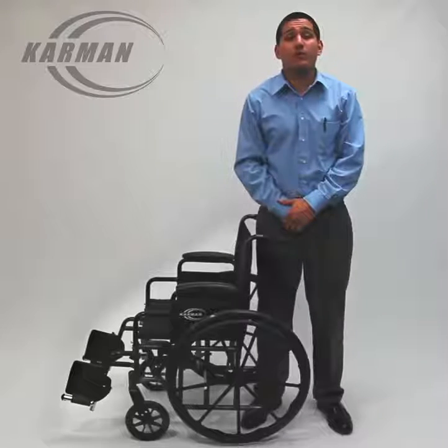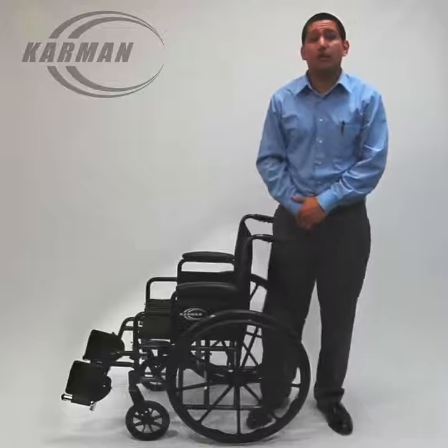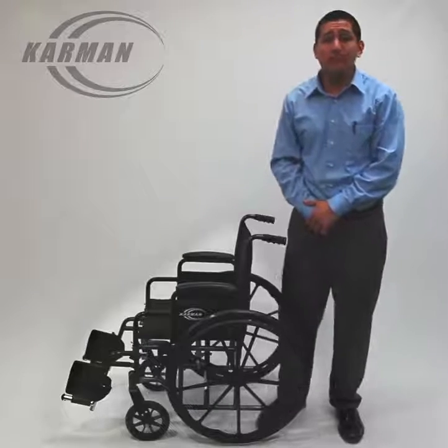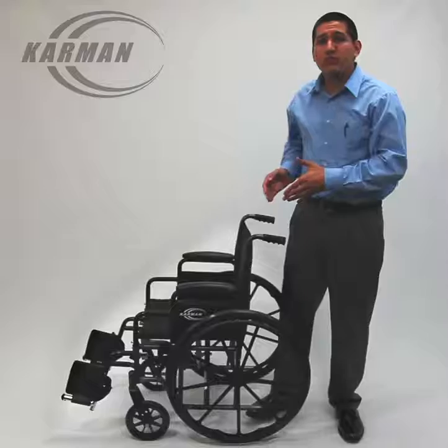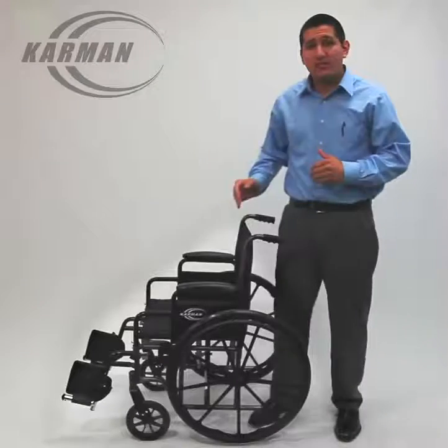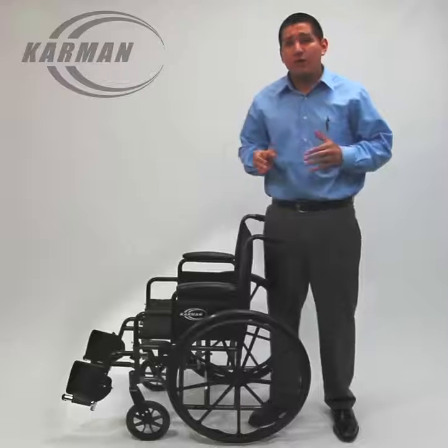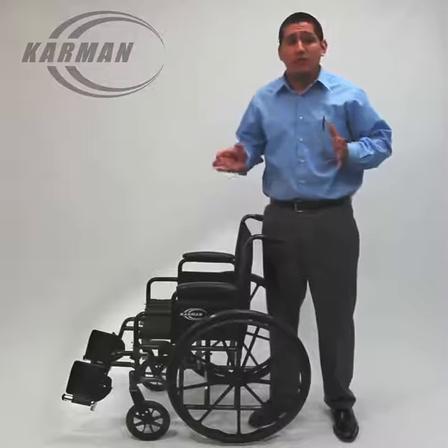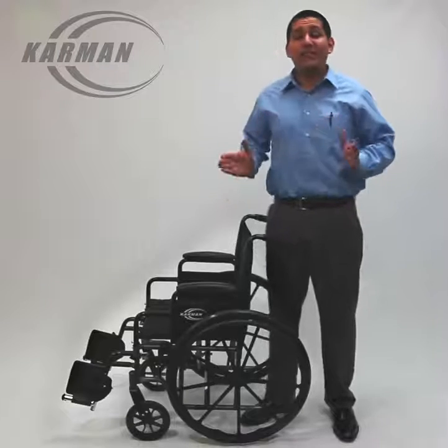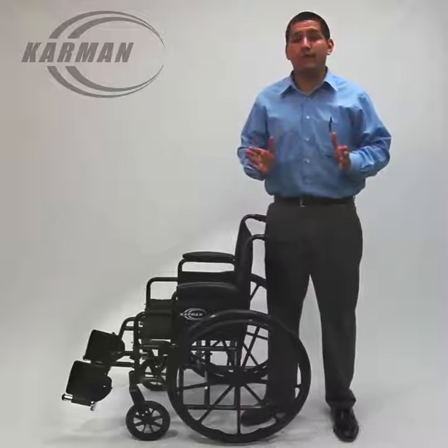Hello ladies and gentlemen, Edward here with Carmen Healthcare. Today's product video will be about our standard lightweight model LT 700T. This model is available in a 16 inch or 18 inch seat width with a depth of 16 inches. This model weighs 35 pounds and has a maximum weight capacity of 250 pounds.